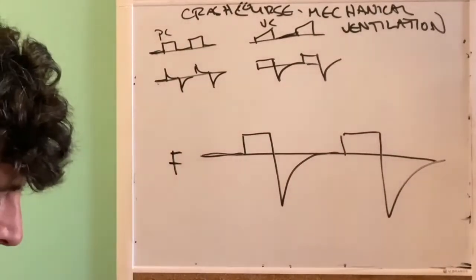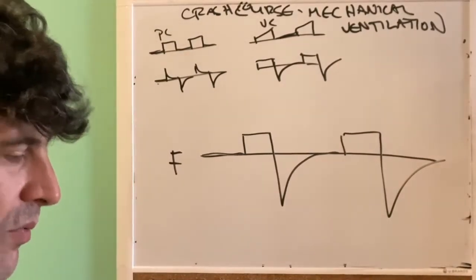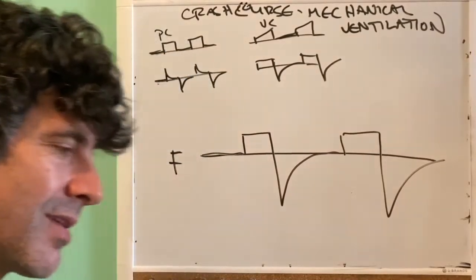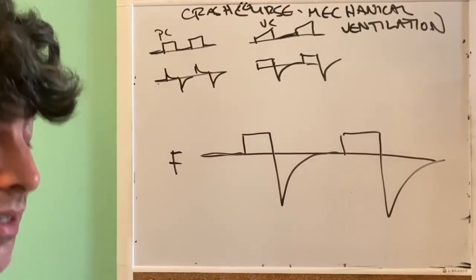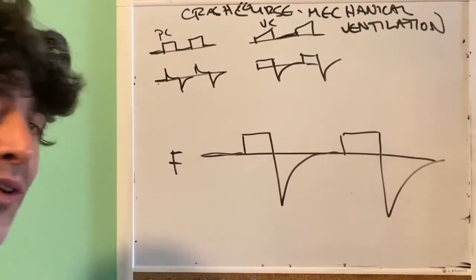So essentially, that's what we're talking about when we talk patient-ventilator interaction. We're really now talking about desynchrony, and when someone says, "Are they desynchronous?" If you know the normal scalars, you can start to understand what desynchrony means, because the normal scalars won't look normal.